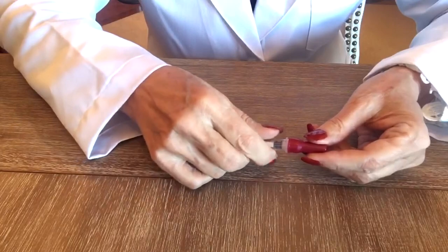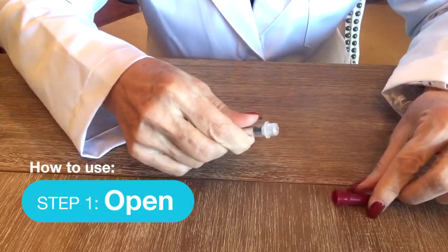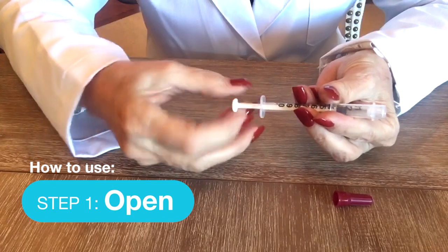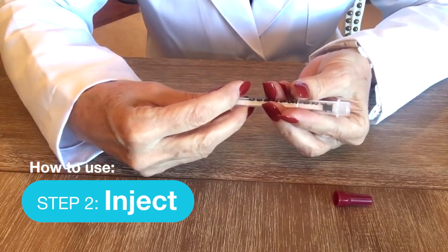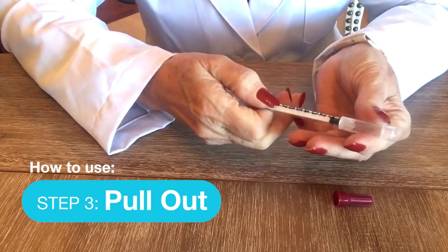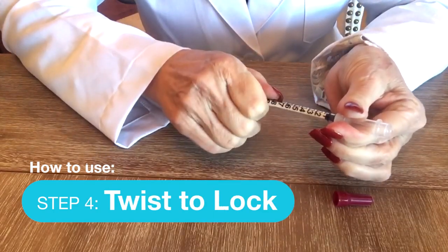For our safety syringe, you're going to take out the cap, pull back on any medications you need, inject it into where you need, and then when you're finished you're going to pull out on the safety mechanism and then turn it until you hear a click.